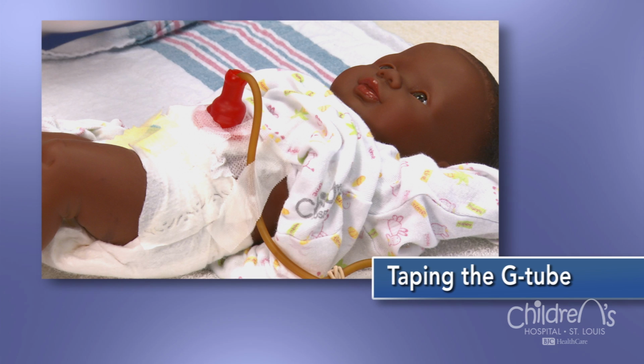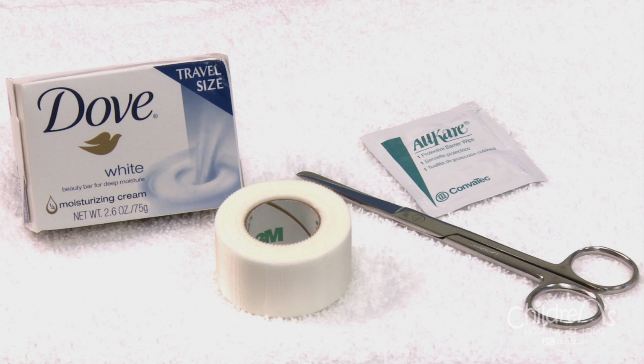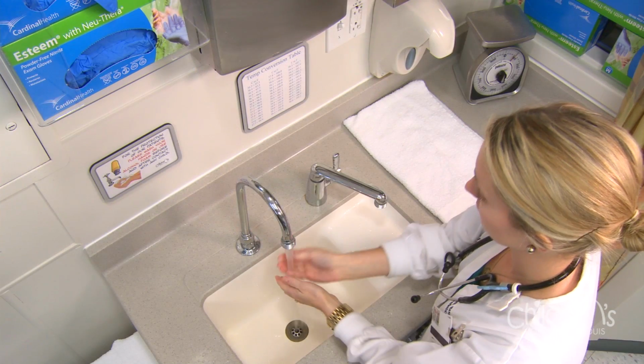In order to prevent pulling on the tube during feedings, you'll need to tape the tube. Before you get started, assemble your supplies. You'll need scissors, skin wipes or skin prep, a washcloth, and tape ordered through Home Health. Once you have assembled your supplies, follow these steps.